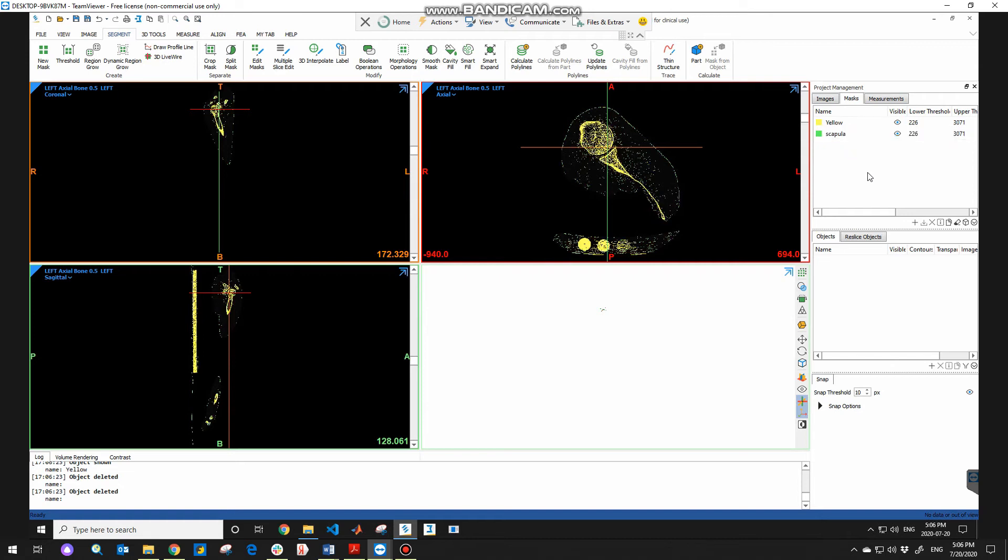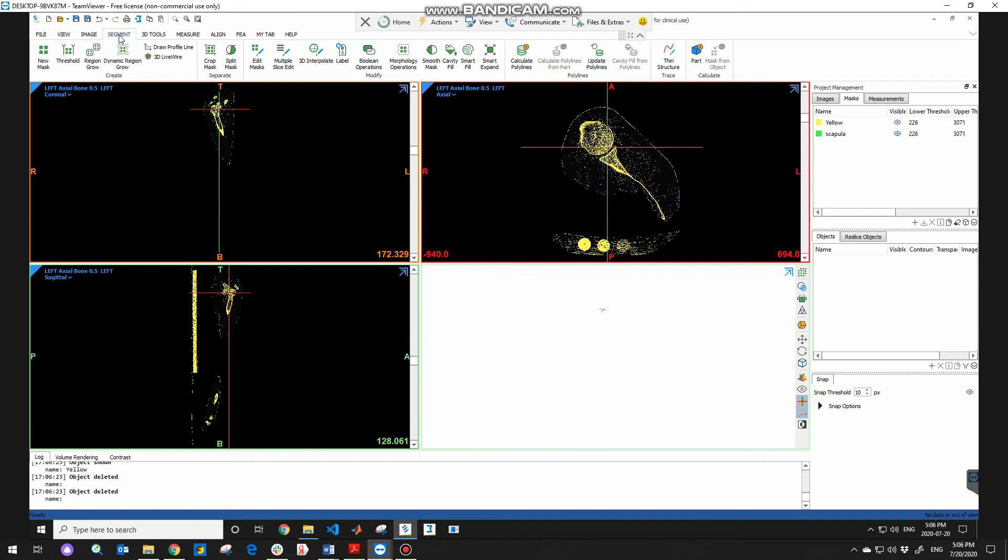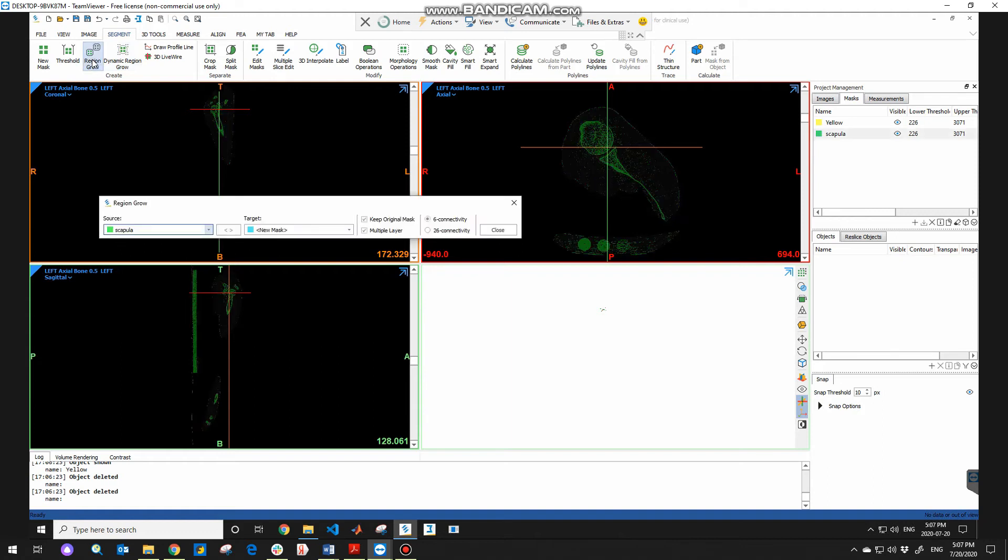And you can see it right away if you want to segment out the bone manually. It's a little bit tricky and also extremely time consuming. So what you're gonna do is go into the segment section here in the taskbar and use the region growing feature, which is the third one.